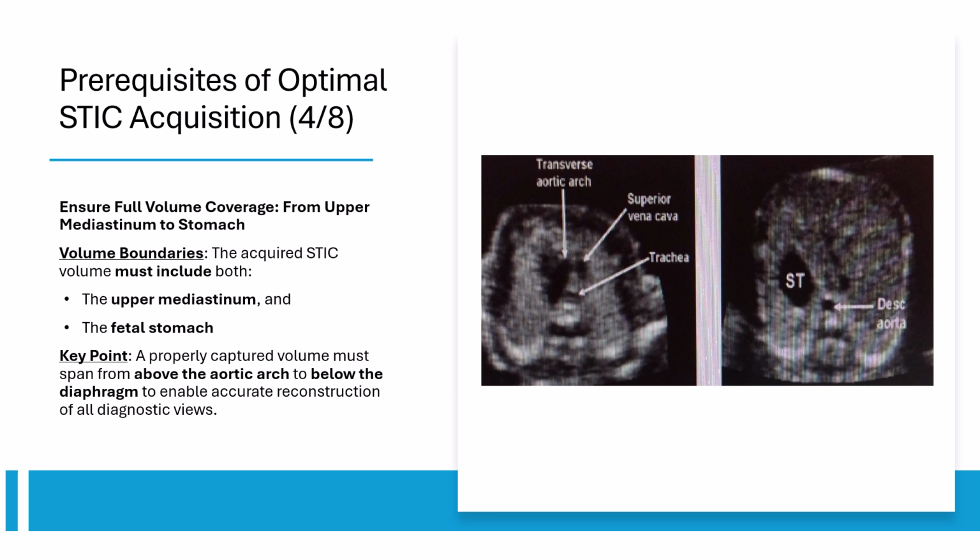In summary, a properly captured volume spans from above the aortic arch to below the diaphragm, enabling precise reconstruction of all key diagnostic views.